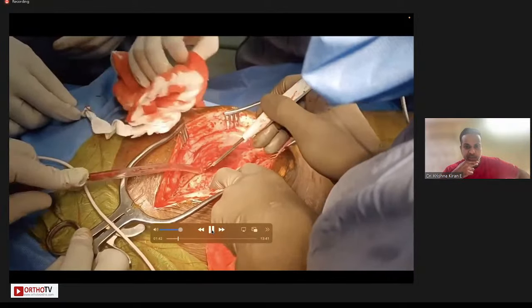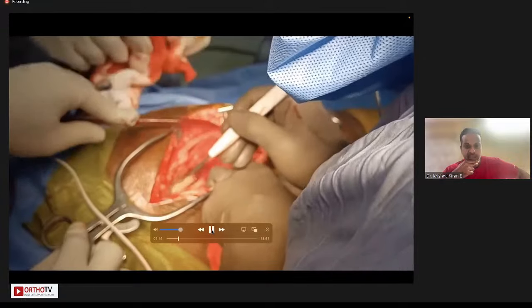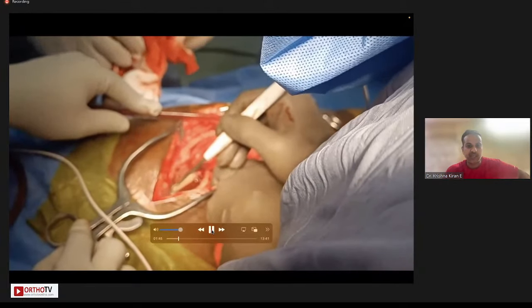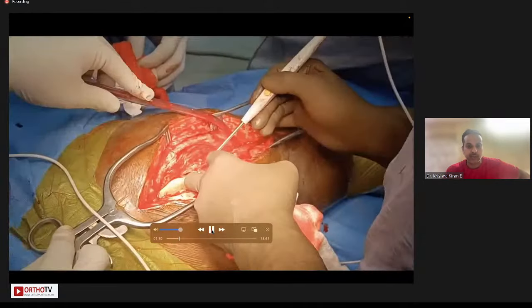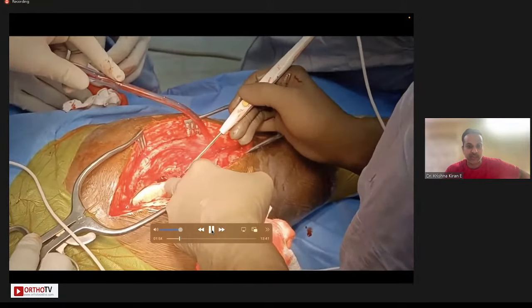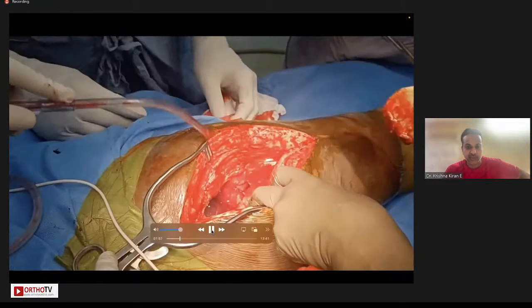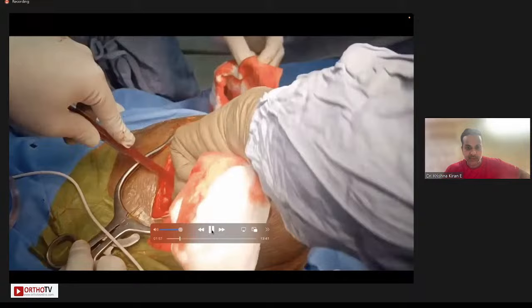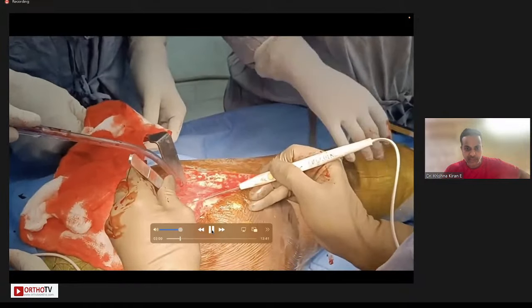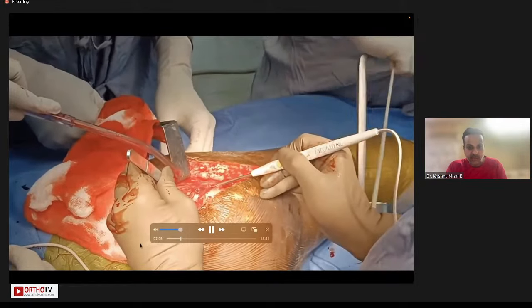So here I'm exposing it, and because it was a spacer which was put by me, you can see that the exposure is much easier because I've already carried out all the femoral releases which were needed in the first place. So since it's just 6 weeks, it is much, much easier for me to do the surgery. So now we are excising all the scar tissue which is present around the acetabulum.